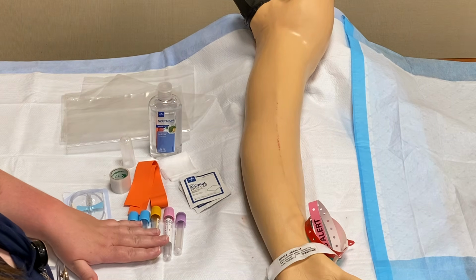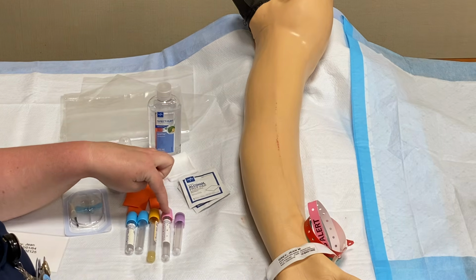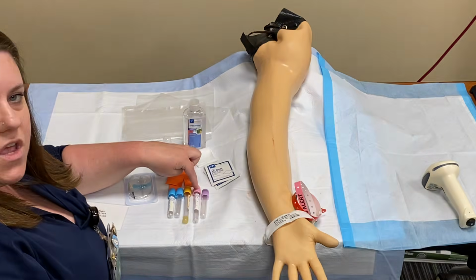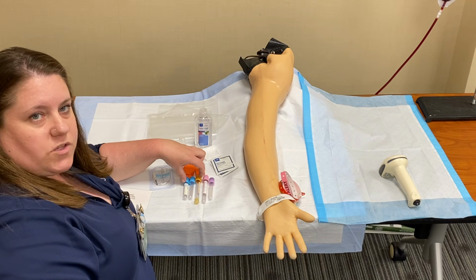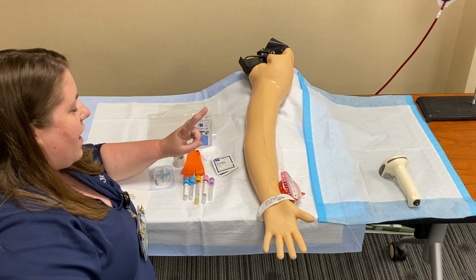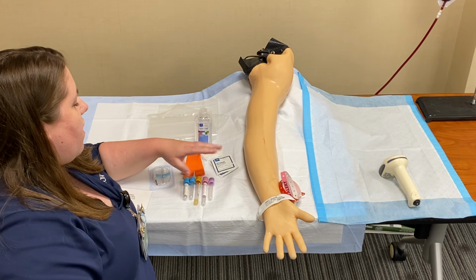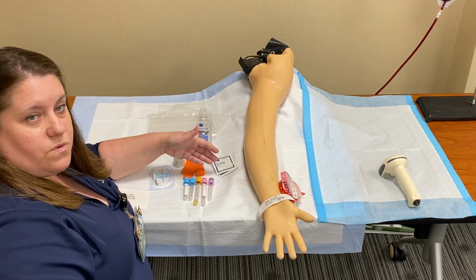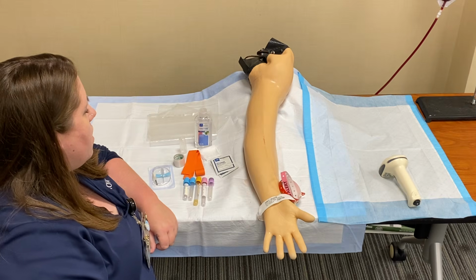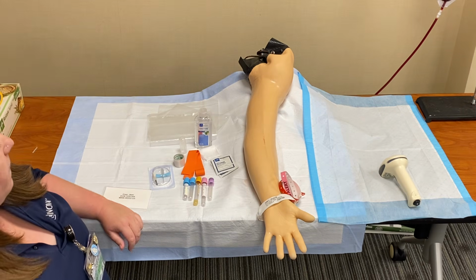If you are at Fairfax, you need to bring in a total of 4 bags because your type and screen, your blood bank specimens, go to a separate location, the blood bank. And the rest of your specimens will go to the lab. So you'll need to bag them up in 2 separate bags, so a total of 4 bags. Any of the other hospitals or locations, all of your samples go to the same place, so you would just need 2 bags. Once I've gathered all of my supplies, I'm gonna head to the patient's room.